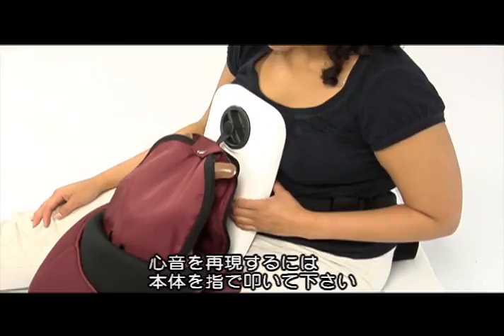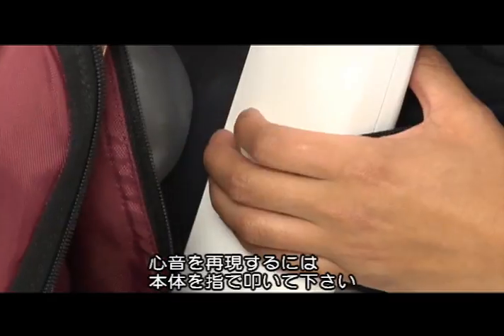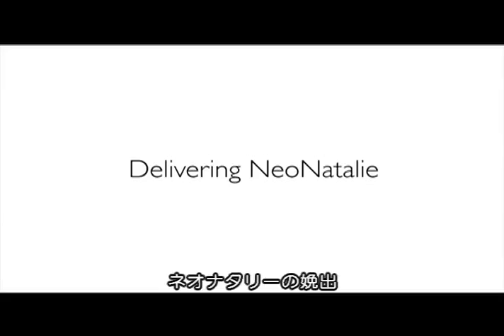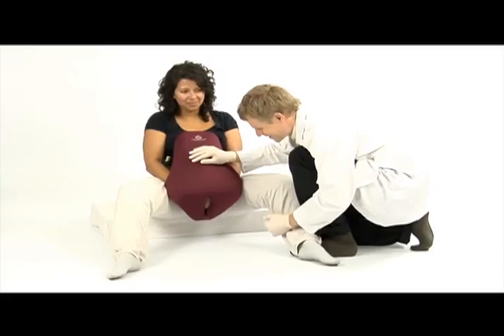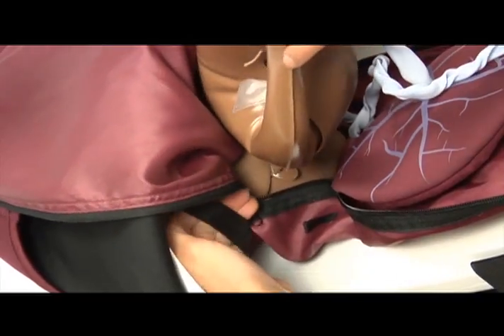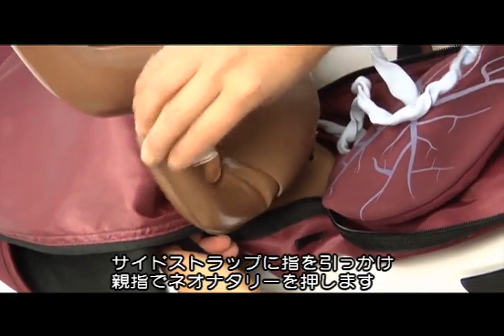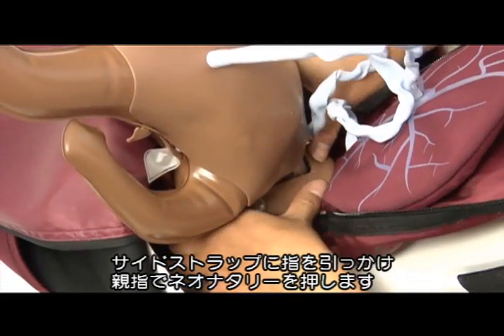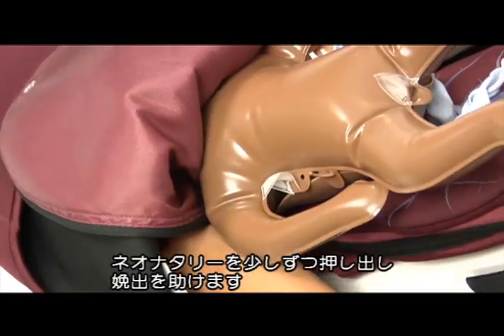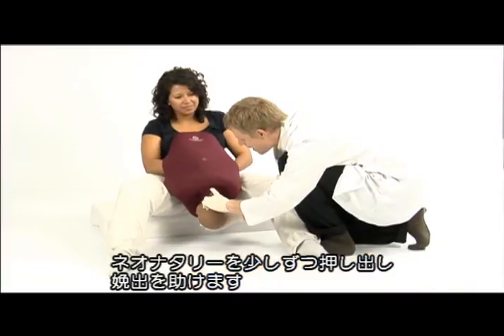Use a finger to tap on the back part of the skeleton to simulate the desired heart rhythm. Place your hands into the uterus. Hold the side straps with your fingers and push down on Neo Natalie's body with your thumbs. Assist the delivery by gently pulling the straps with the push of Neo Natalie.